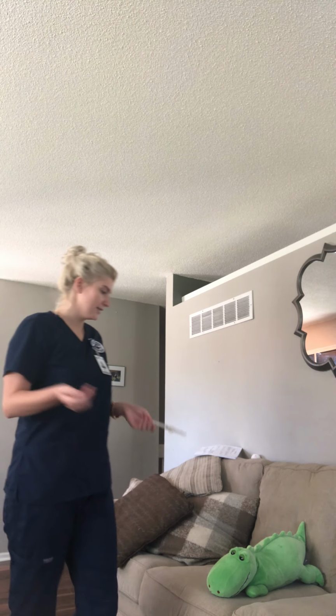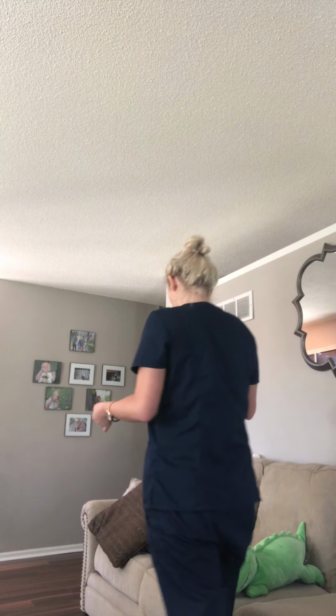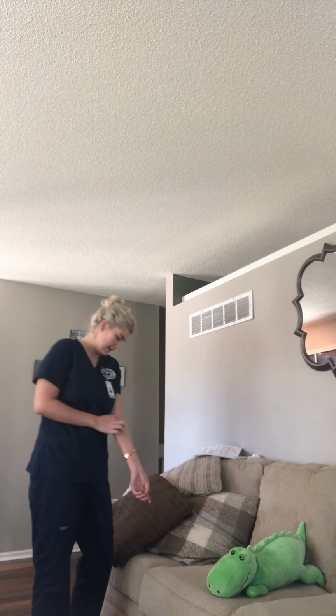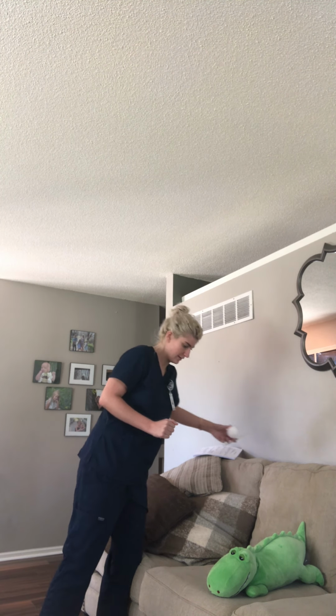And then after you do that, you can draw a curtain for privacy, and then you can apply clean gloves, and then you can drop your stuff at the patient's bedside. So you can do hand hygiene, apply clean gloves, and I can prepare the site for the medication. So I take an alcohol swab and I clean the part where I'm going to be injecting, and then I'm going to be injecting into this.